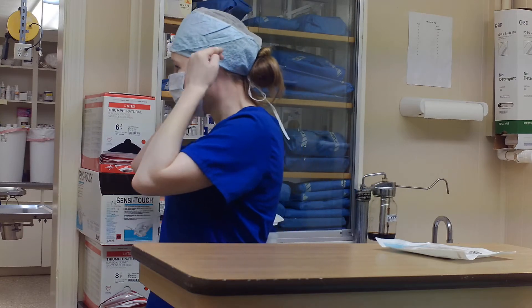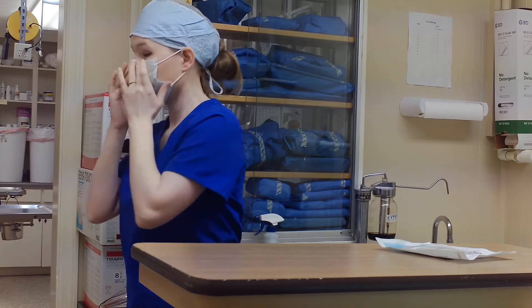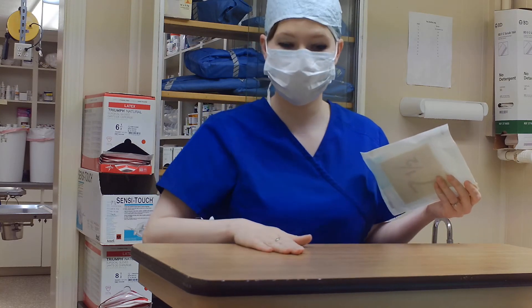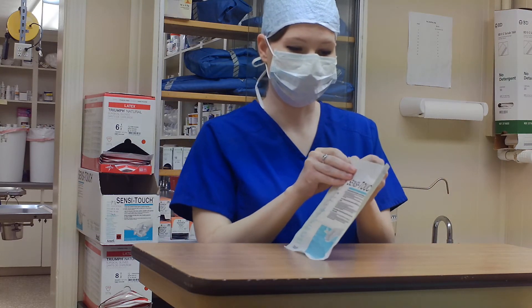I have my mask going upside down. Okay, now we're good. And this is our surgery table that we have designated for our surgery room. Let's go ahead and show you how to do this.